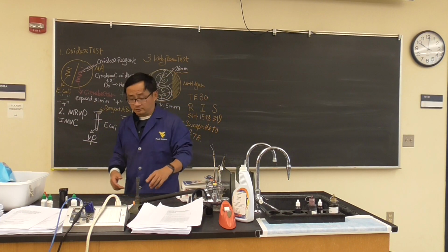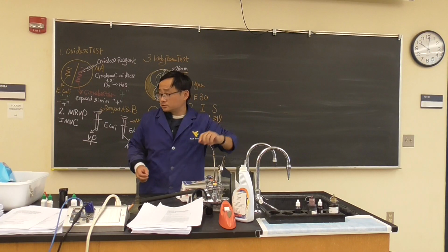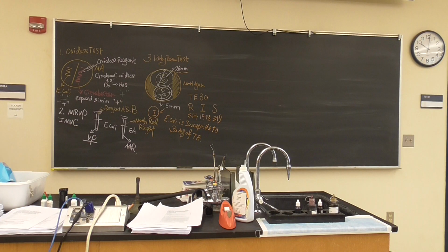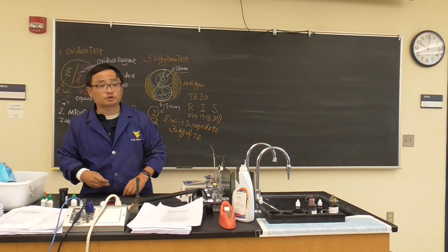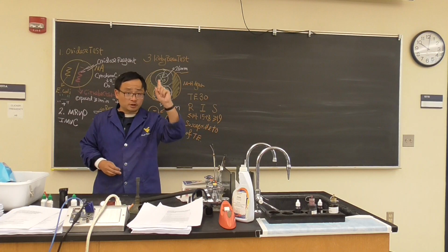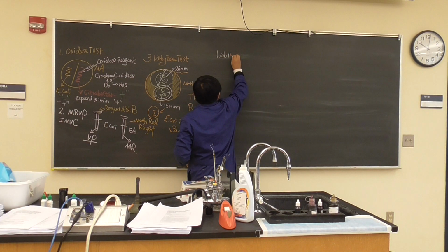Okay, what are we going to do today? We're going to do something fun. Can you put a jar? The back there is a candle jar you need. So what we're going to do today is we will get a cotton swab and blood agar, and we will do an isolation by swabbing the culture. Two of you will work together, and I also want four of you to get one nose, the bacteria from the nose. So that will be today's lab, lab 15.